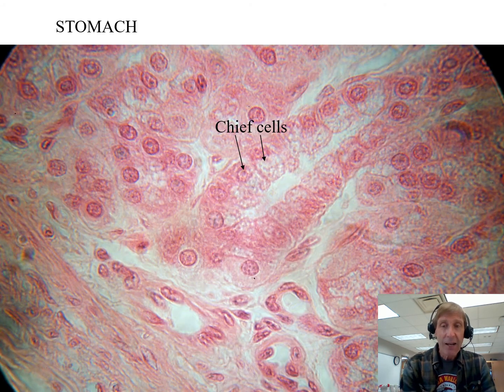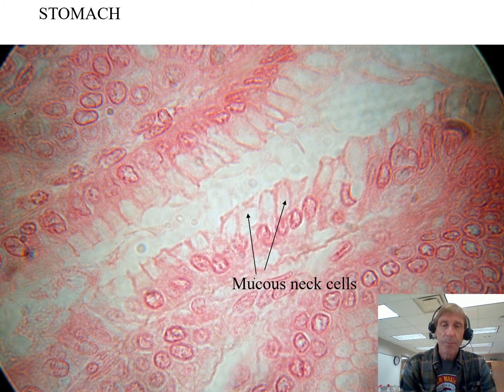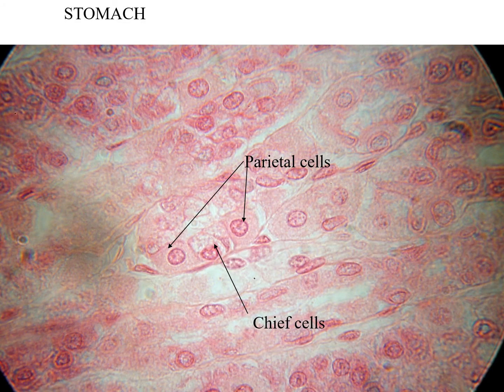Again, this is just a high magnification slide of the stomach. I typically don't use it because it's too hard with most of our slides anymore to get the necessary characteristics to distinguish the different populations of cells, but that's part of a gastric gland there. Again, similar high magnification slide of a gastric gland. I typically won't use this. These are the mucus cells secreting the mucus that coats the stomach. Don't worry too much about them. They're on here. They're kind of interesting, but I typically won't use them.